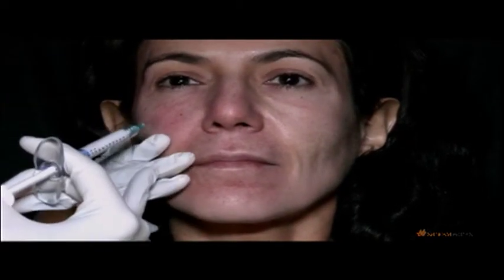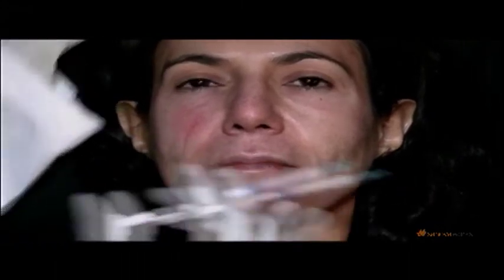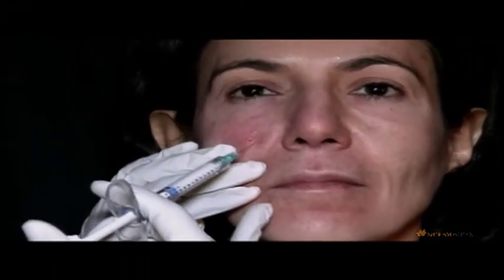Now, can the audience, particularly the residents out there, see what we're talking about? Because it's almost like learning to view or whatever. So in the premalar area, you can see that little hollowing or sulcus that's present there. Take a look at some babies. If you see running away, they're like stuffed apples. They're like extremely attractive, big, volumized cheeks. And as we get older, we lose the fat, our skull atrophies, and we get this sinking area. It's not as attractive. Part of youth is to have nice, convex curves. So what Hema's doing is replacing some of that volume loss and restoring that curve.